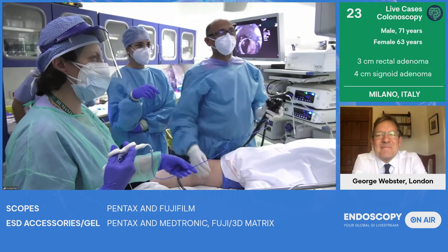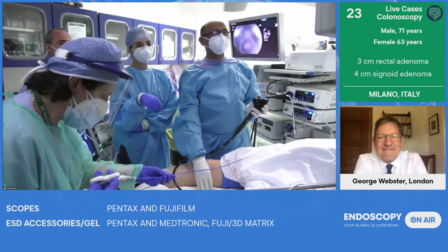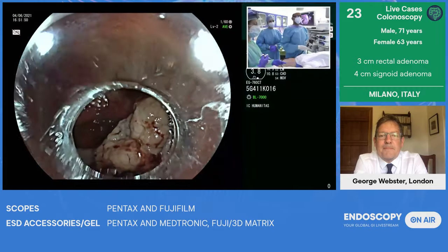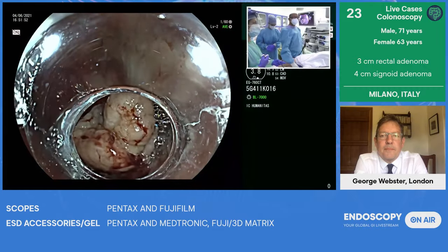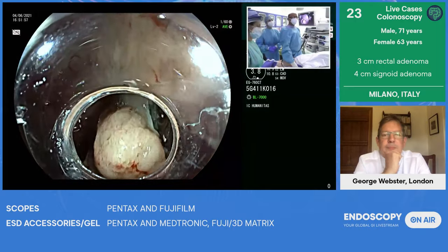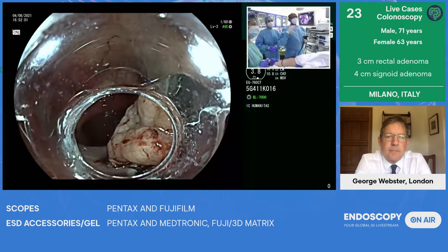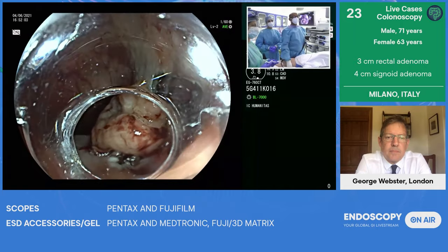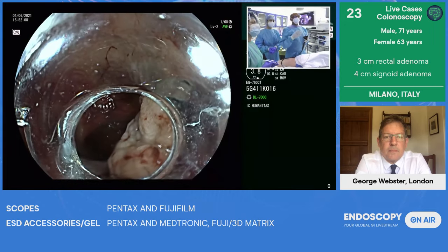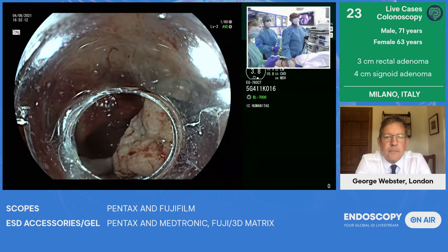I'm in suite 4 with Alicia, one of the rising stars, and the rest of Professor Rapisarda's team. We have a rectal polyp, and lots of people promote the rectum as the best area to learn ESD. If Thomas Roche is listening, he'll agree with me that it is a nightmare situation in the rectum with the venous plexuses, vessels, and bleeding. What we want to do is show you a novel knife and a novel technique of doing ESD.